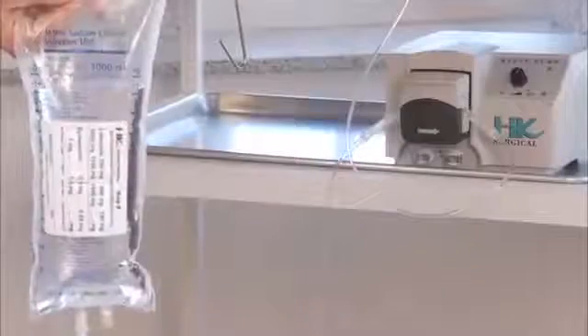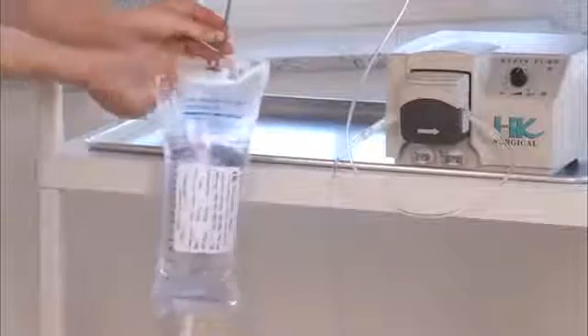Problem: tubing continues to drip after the pump is stopped. Possible cause: gravitational flow. Solutions: hang the IV bag level with the pump. Possibly try HK CVT tubing, specifically designed to eliminate dripping.